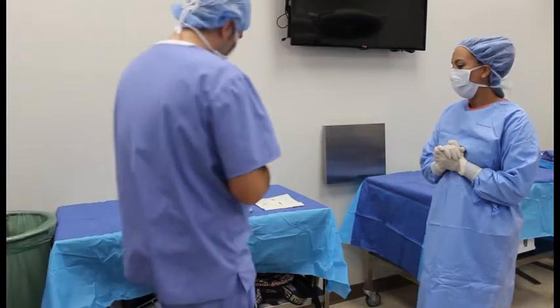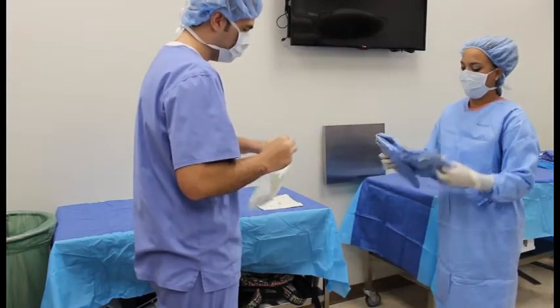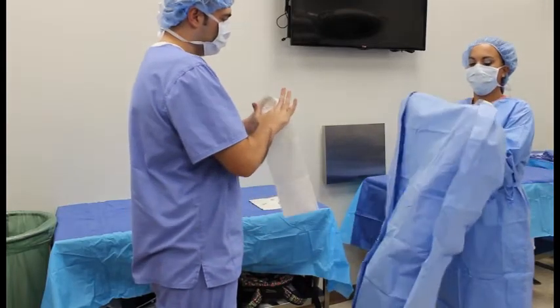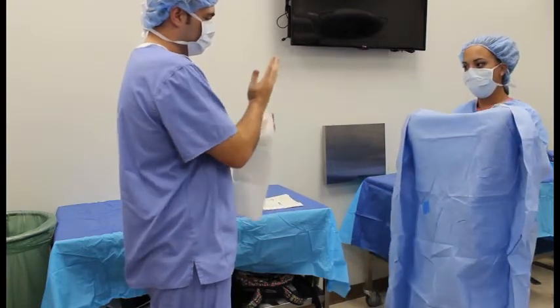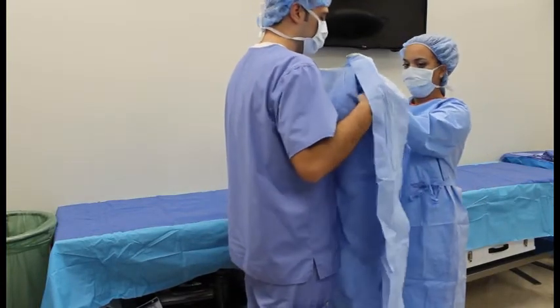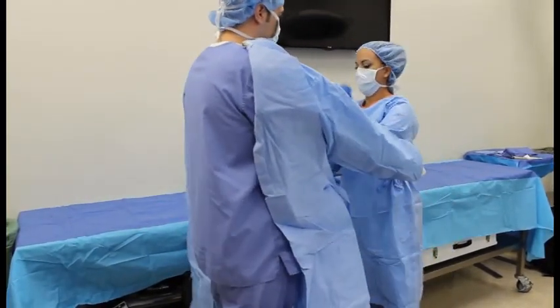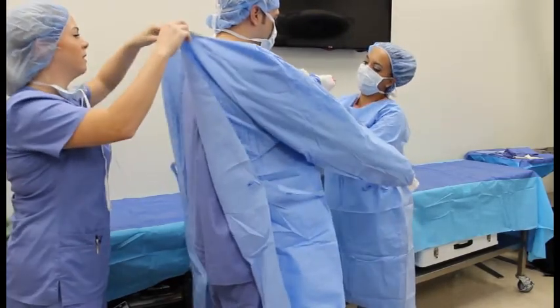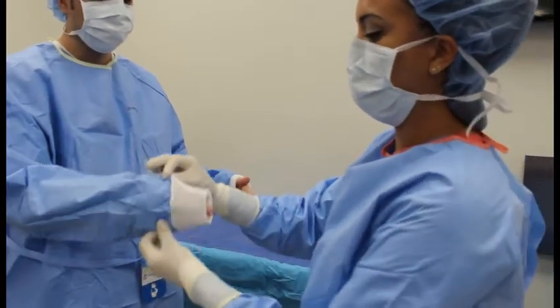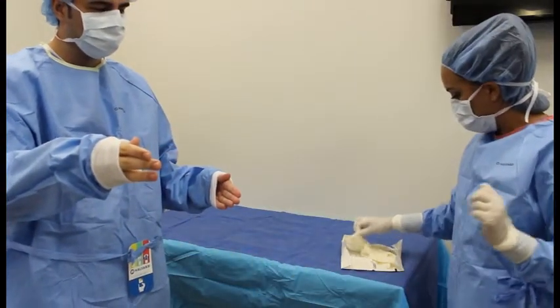After you gown yourself, you will then begin to gown the other staff members in the operating room. Starting with the surgeon, who will first dry their hands. Open their gown facing towards them and assist them in putting on their gown, dropping it at their shoulders. A non-sterile team member can then come over and tie theirs in the back. Assist the surgeon by pulling their fingers out of the cuffs just a little, and begin to put their gloves on, always starting with the right hand.